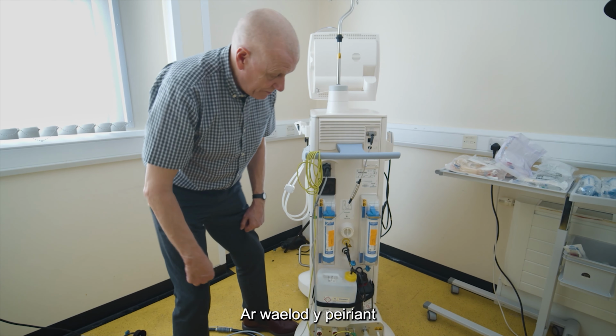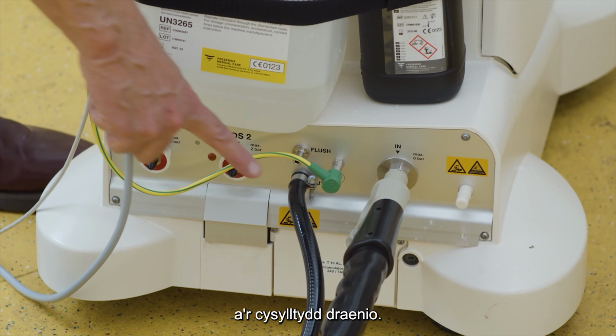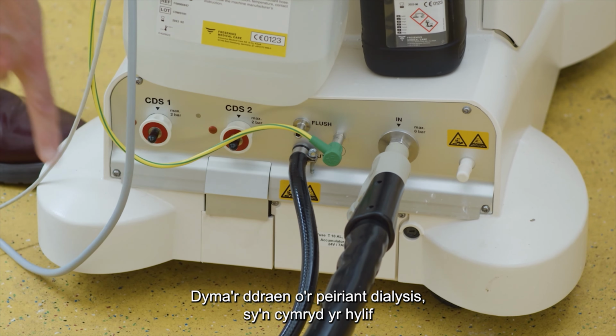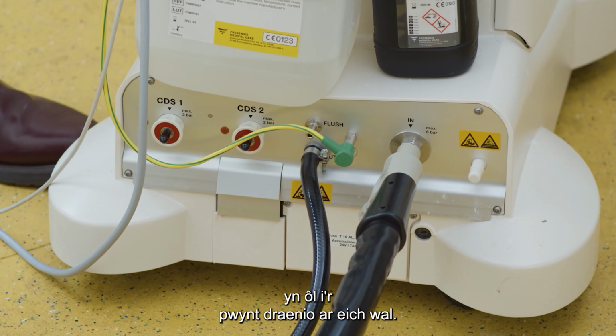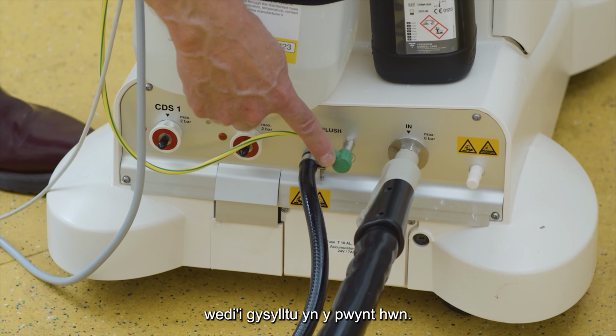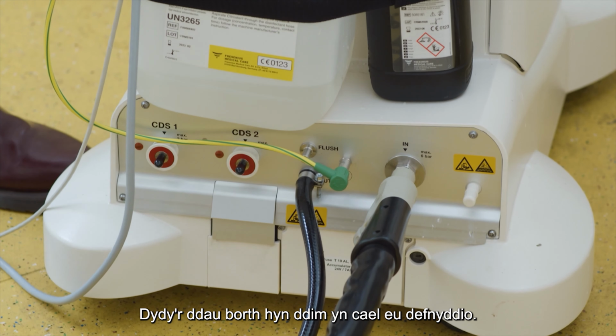To the bottom of the machine, you have the water connector from the RO. You have the drain connector. This is the drain from the dialysis machine, taking the fluid back to the drain point on your wall. The equipotential bonding cable is connected at that point there. These two ports are not used.